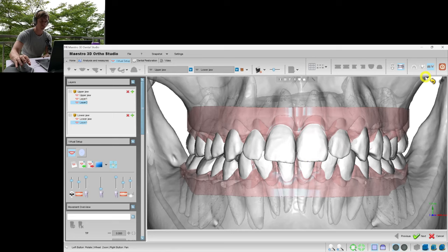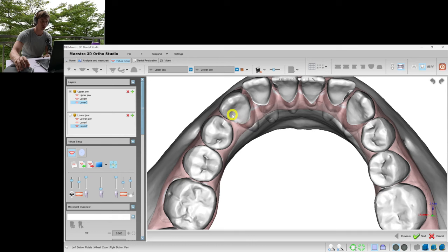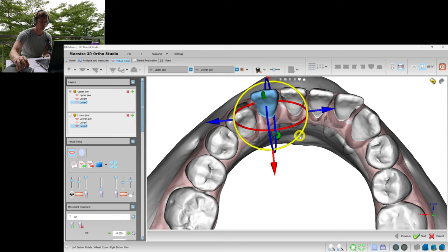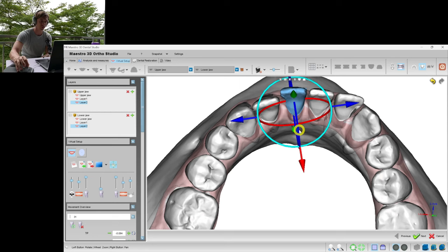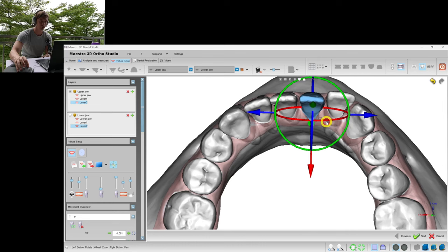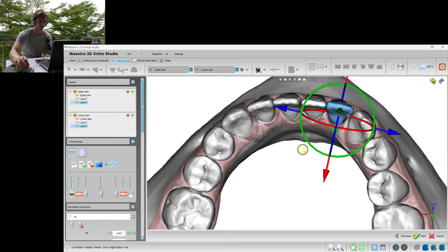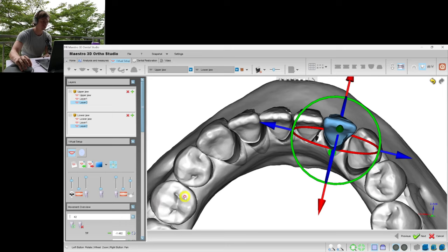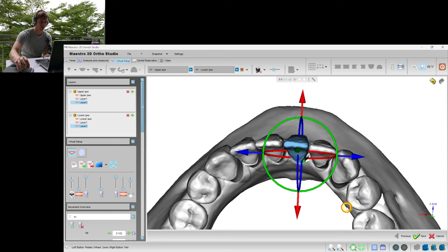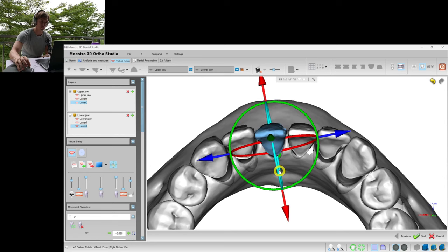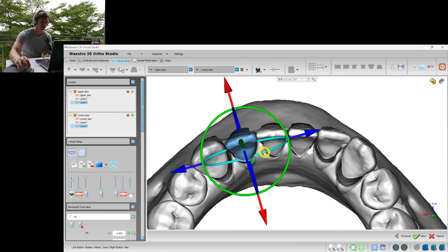Let's go to the lower arch. Don't forget to create a new layer. Now we retract the frontal teeth and also we are finalizing the rotations. Let's remove the gum to see the roots better. We are aligning the incisors.